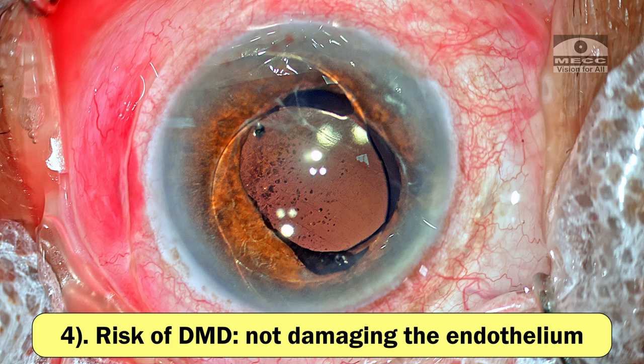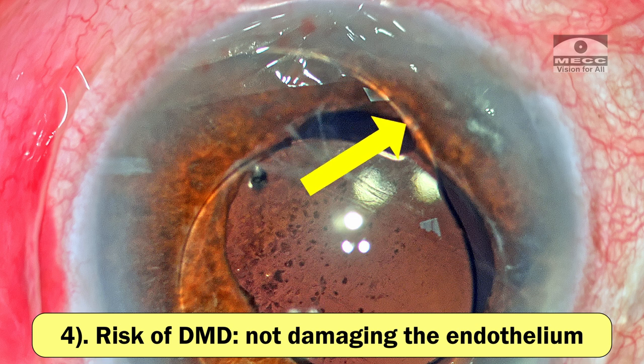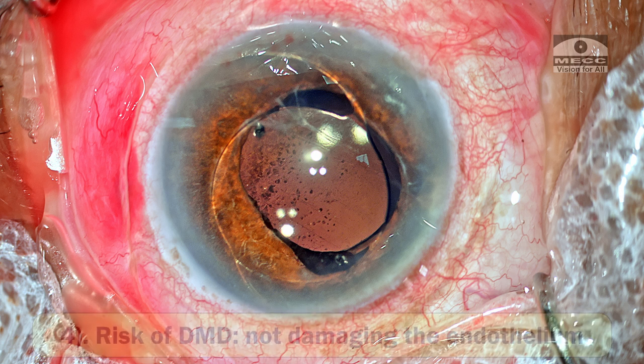Other things would be that I need to be careful not to damage the endothelium. There could be a risk of causing a Descemet's membrane detachment, especially from the inferior part because the haptic is quite close to the cornea there. So I'm going to use an adequate amount of OVD to safeguard the corneal endothelium before pulling the lens out.